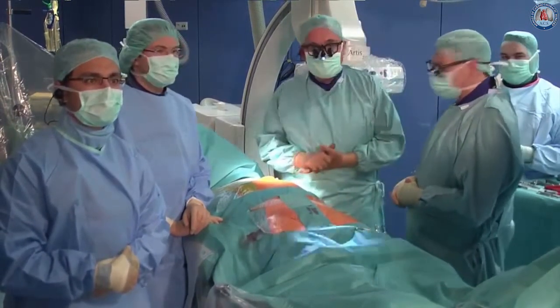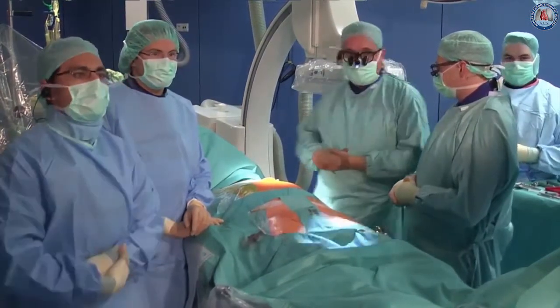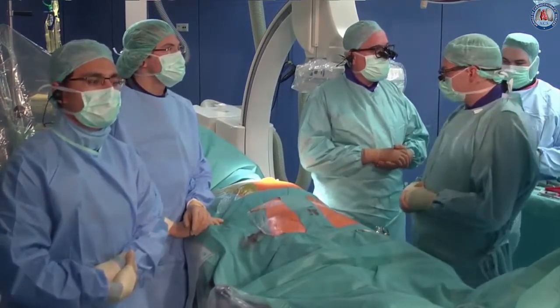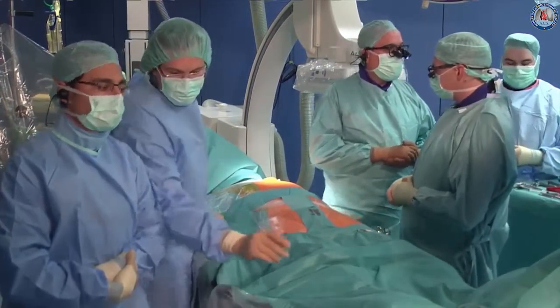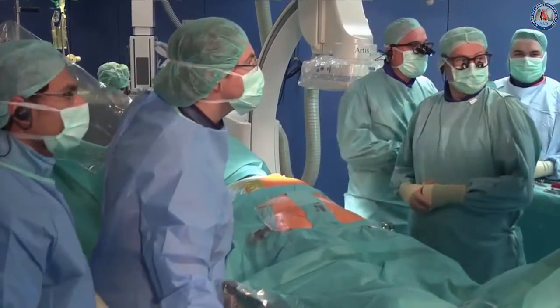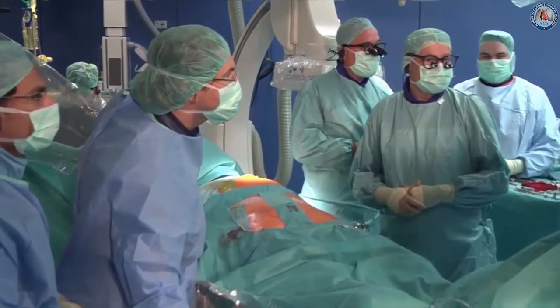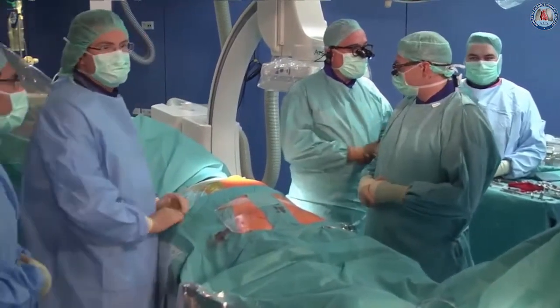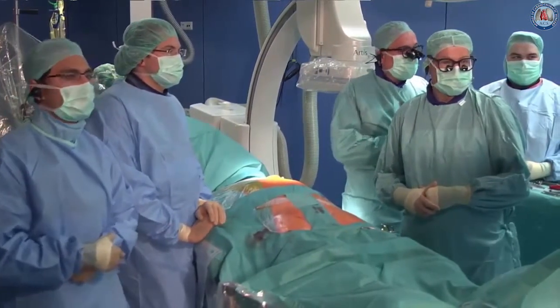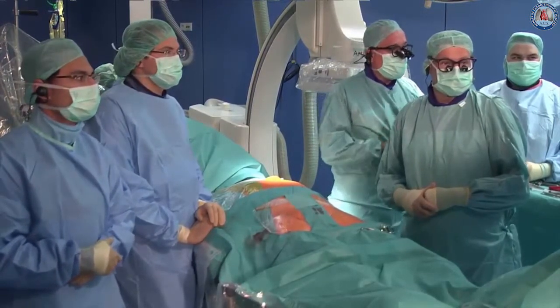I'm not sure if Ms. Eismann can. But how do you know whether you have them just perfectly? Yeah, because I know where the commissure of the non-coronary and left coronary cusp is. Is it posterior and anterior? And then I can turn my delivery system and check whether my commissure is anterior and posterior. And then I can try to implant the valve in commissural alignment. That's possible only with that valve.